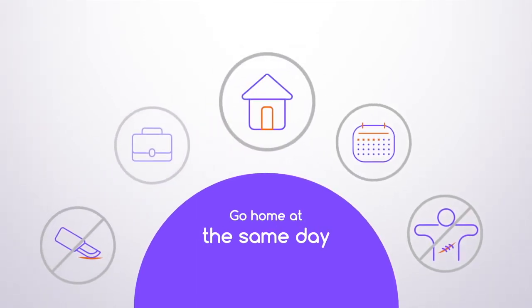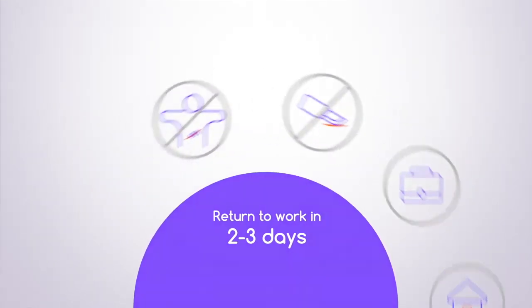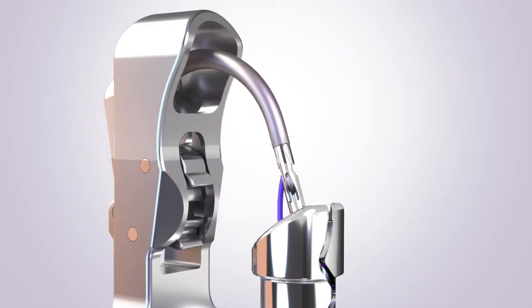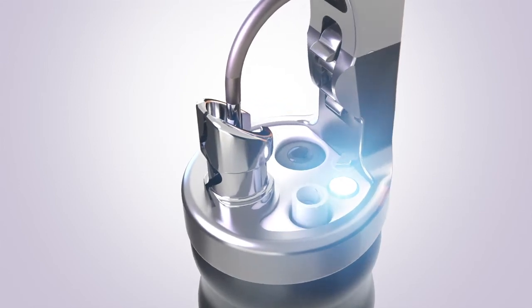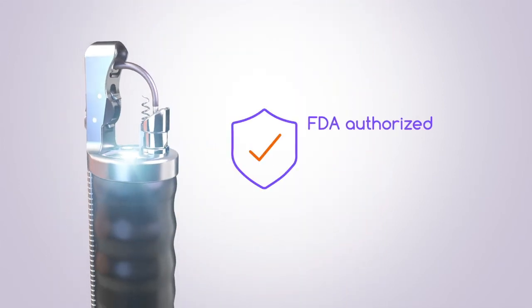Most patients typically go home the same day as the procedure and can return to work in two to three days. The Apollo ESG system is the first and only device to be authorized by the FDA to perform ESG for weight loss.